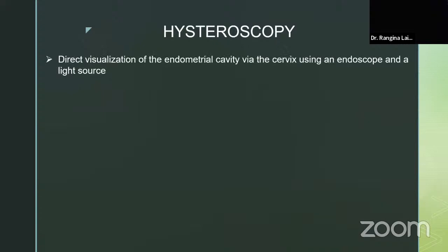We all know that when I first started hysteroscopy, I thought it was only about visualization of the uterine cavity, just to see the endometrial cavity and the shape of the uterus. But later, as I advanced in this field, I realized it's something more than the uterine cavity. We can say it is a combination of vaginoscopy, cervicoscopy, and uterine cavity. So whenever we insert a scope, my aim is always first to see the vaginal cavity.